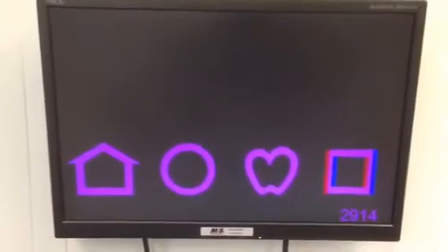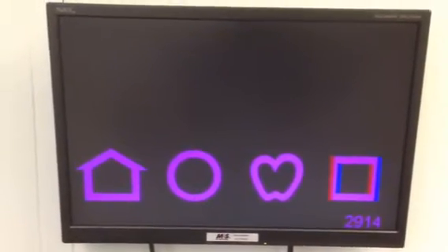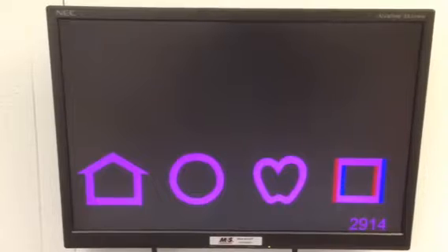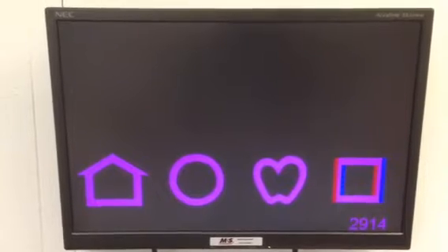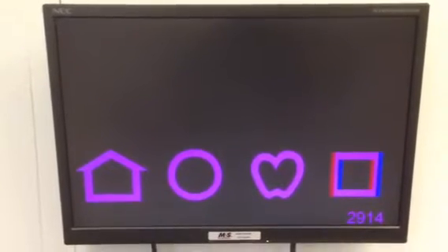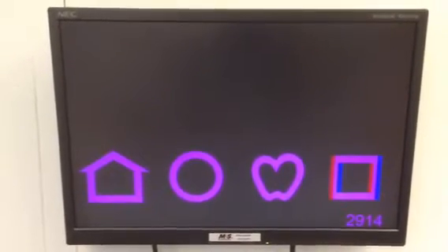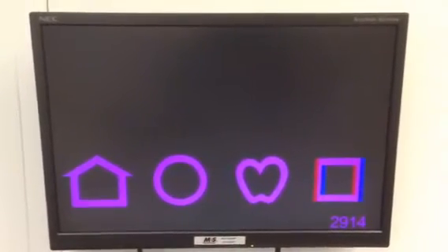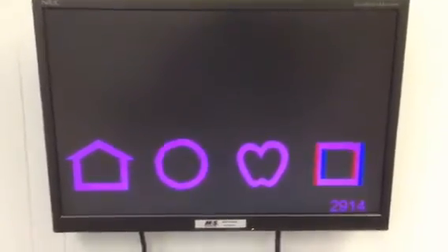And of course you've learned that this is a 291 arc second demand with target number 4 being the answer if you don't cover that up as I've been known to do on proficiencies. So to change the demand on here and also to see the answers in the upper left of the screen you're going to want to use the up and down keys or the alt up and down keys. Either one will work.